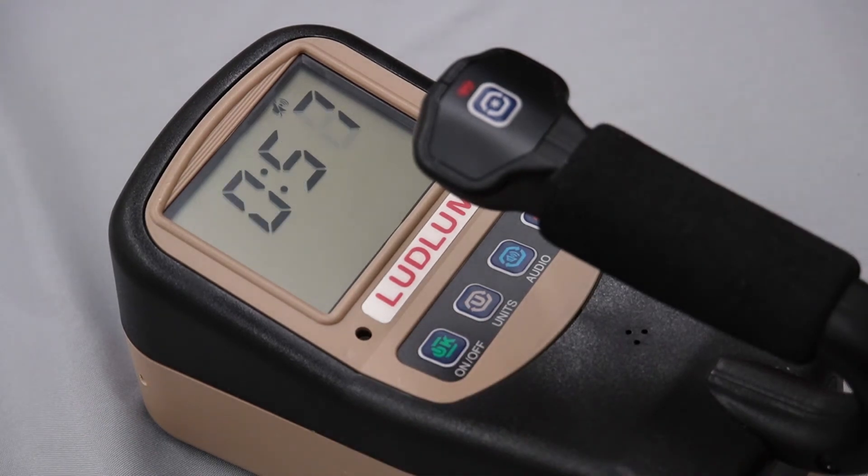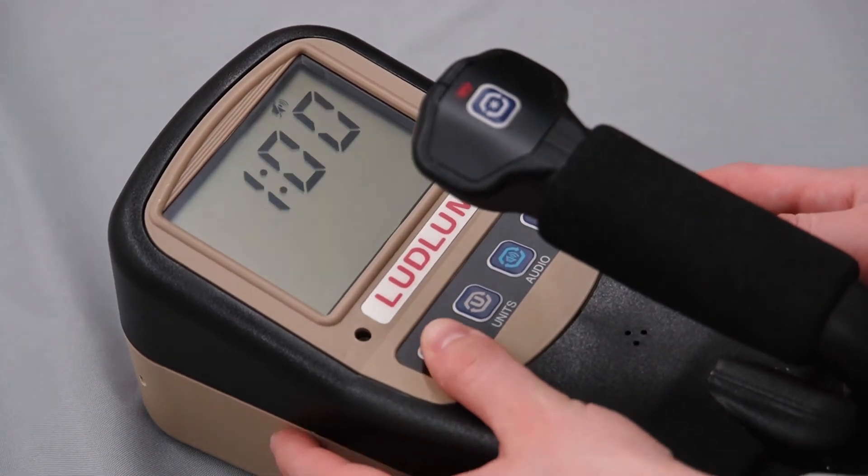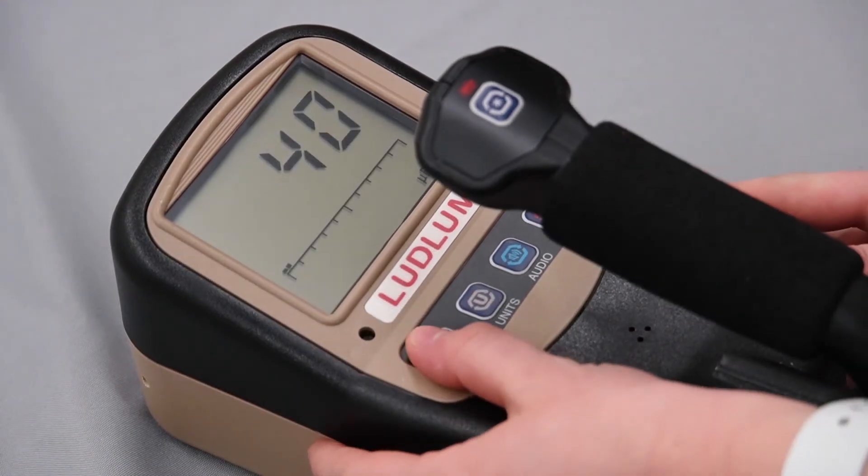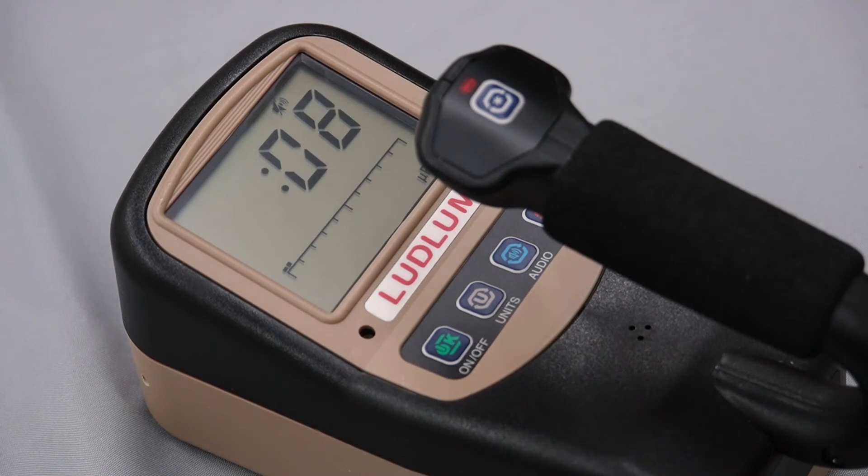If the button is pressed again during the count, it will reset the clock to the count time. When sigma audio is enabled, pressing the on/off button will take a new background reading and update the sigma audio level in rate mode only.